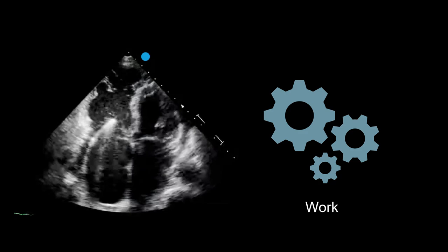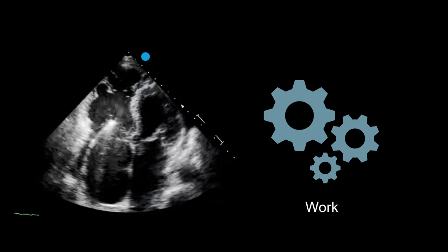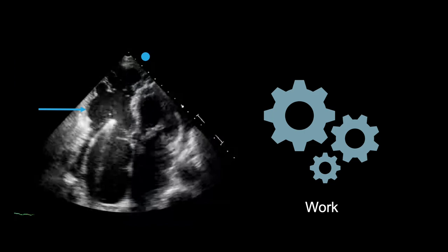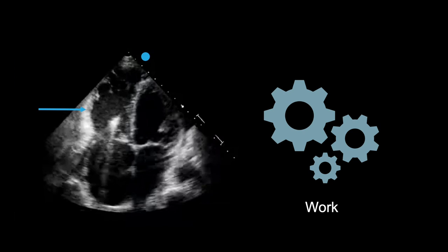Now, its motion. The muscle is not moving as much as it should. In the normal right ventricle, we should see the muscle move towards the interventricular septum during systole when it contracts. In this case, the motion of the free wall of the right ventricle is barely visible, and it is the interventricular septum that appears to be moving. This is an extreme case of right ventricular failure.